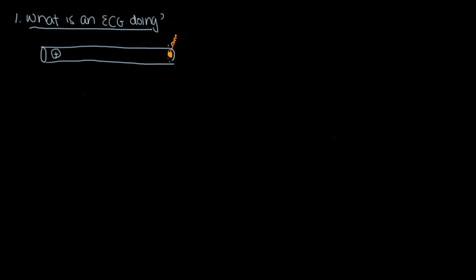And what this sensor is able to do is it's able to tell whether a positive charge is moving toward it or away from it. So naturally, if this particle were to move all the way here and stop right over here, right, this charge, then what this sensor would see is that at the beginning it was still, and then it moved toward it, and then stopped.